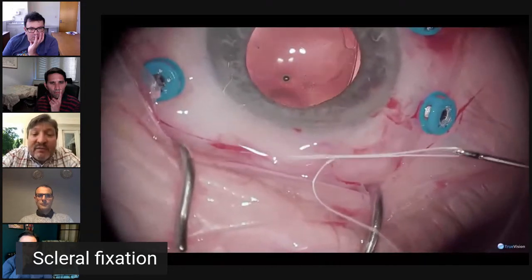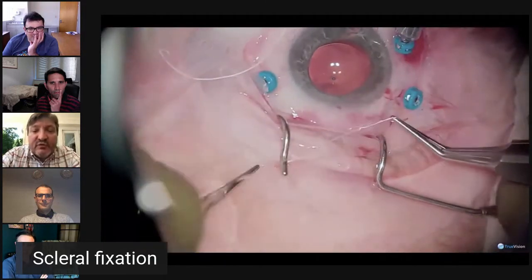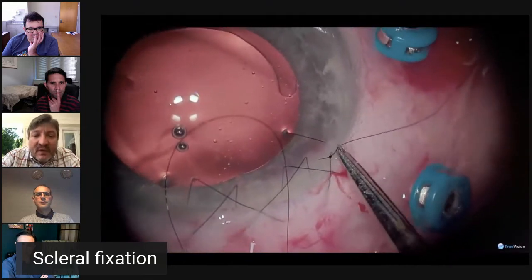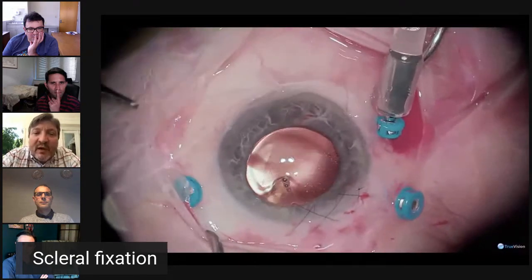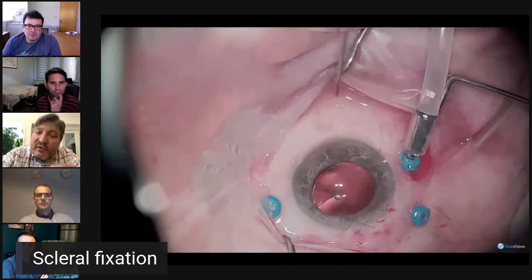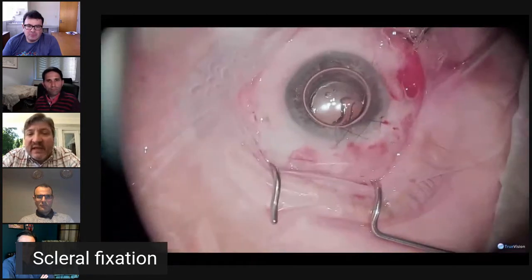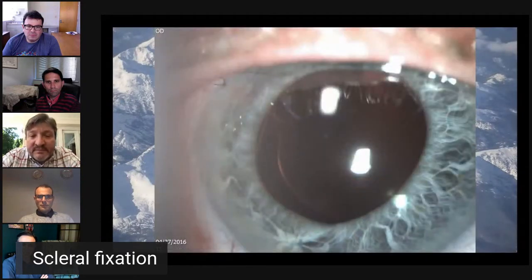Then what I do is I go through the conjunctival opening and bring the Gore-Tex suture loop to the more counterclockwise sclerotomy, tie it, close the wound with a running stitch, and do the same thing on the other side. With a little bit of tension, you rotate the IOL as far counterclockwise as you can, and then with gentle tension on the more counterclockwise suture, we tie the Gore-Tex. Once we're done, we turn the infusion back on, and we rotate the knot intraocularly. There's always some viscoelastic in the back of the eye, and of course the viscoelastic in the front of the eye. And these eyes end up doing beautifully well. That's what they look like post-op day one. They recover very quickly. So I love doing it that way.